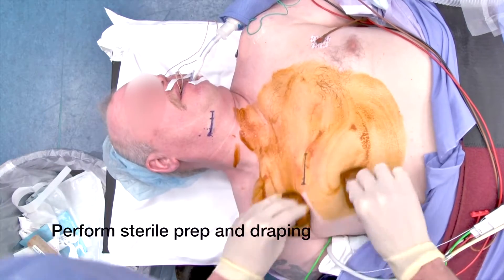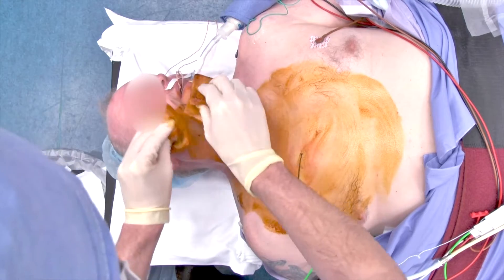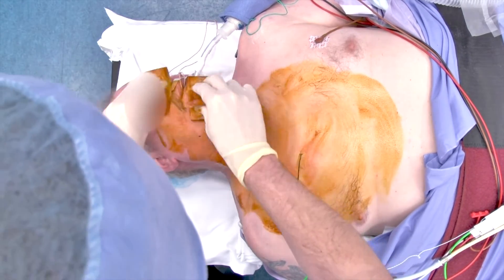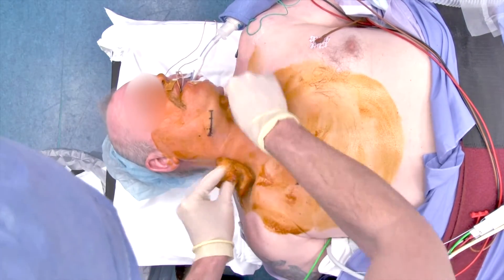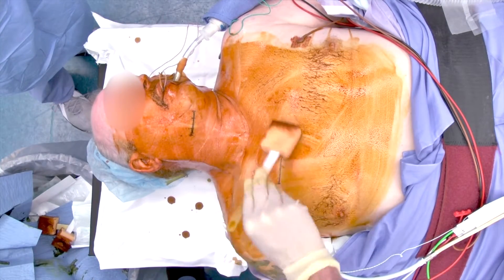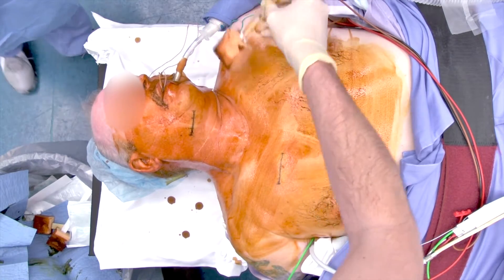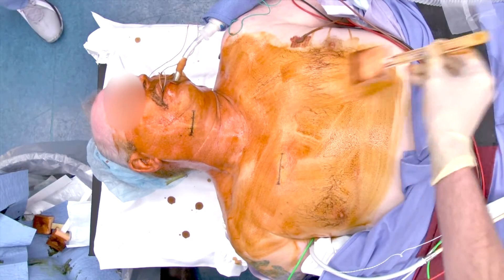One percent lidocaine with epinephrine is my typical choice. The next, which is a very important step, is the proper sterilization of the patient as we want to avoid infection at all cost. We'll typically scrub the patient with the betadine scrub and then lightly paint with betadine after the scrub. An important part is to not blot the paint and to let it dry on its own before we move on to draping.